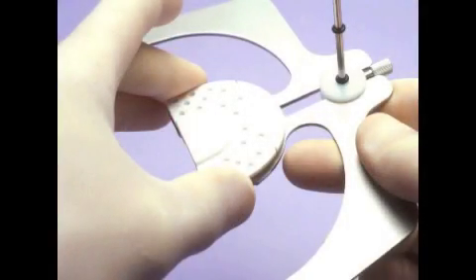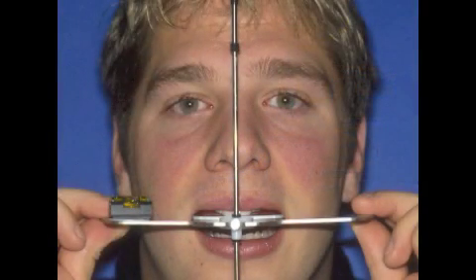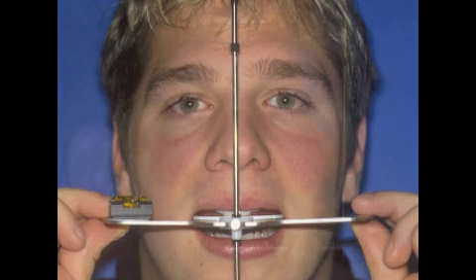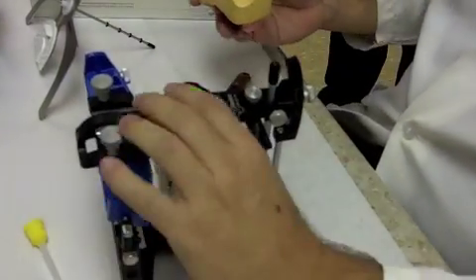So you put one of those white plates on the facebow with the little vertical arm on it, and then you're going to put some registration material only in the posterior area. You want the teeth centered. There's a little notch for the center midline. You want the incisal edges down on the white plate with the facial surface up against that wall. You want to put the midline of that rod in the midline of the patient's face, and then you want to center the facebow itself level with the horizon, so both laterally and anterior-posterior, like you see here with the patient's head in a neutral position.